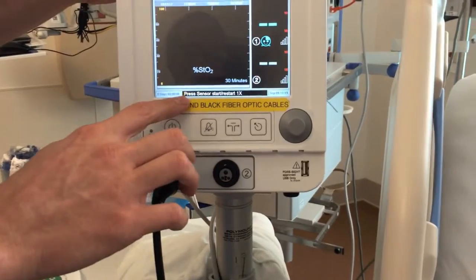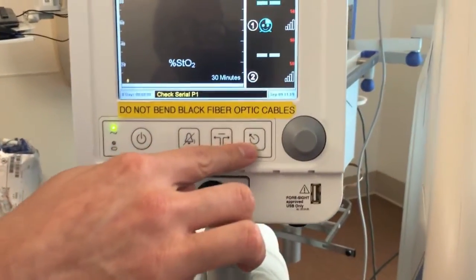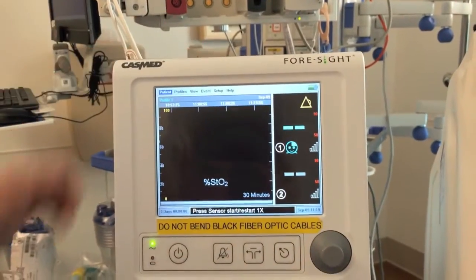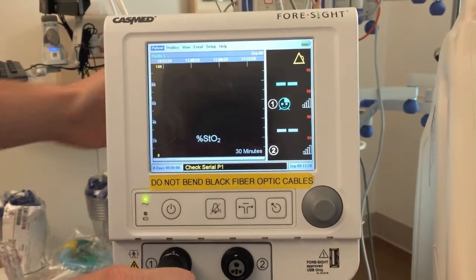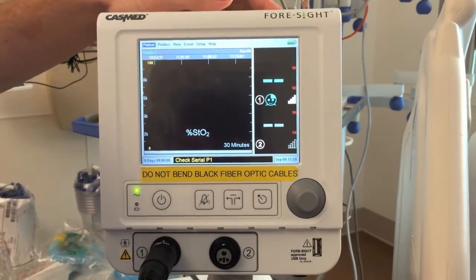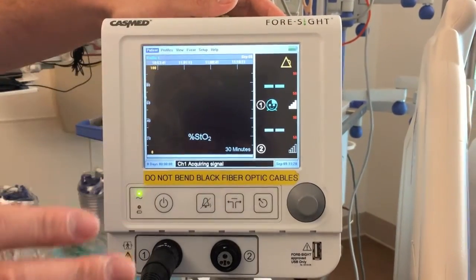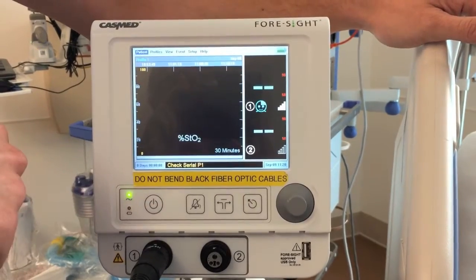Once the sensor is in good position it's going to say 'press sensor start,' which you activate using the button all the way on the right, and it will go ahead and search for the signal. You can see it says it's acquiring the signal. It's also giving a warning about ambient light — if the room is too bright or there's a lot of sunlight it'll alarm, and typically what you would do is cover up the sensor.